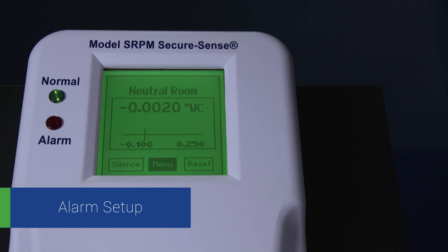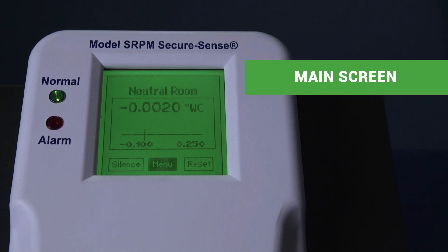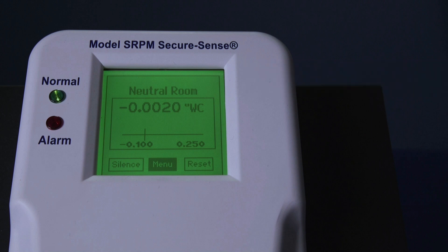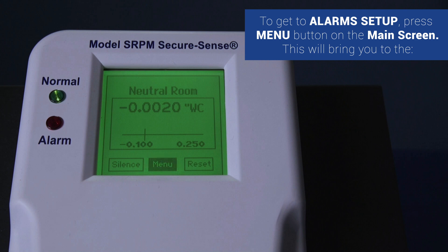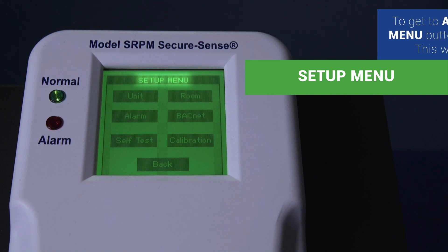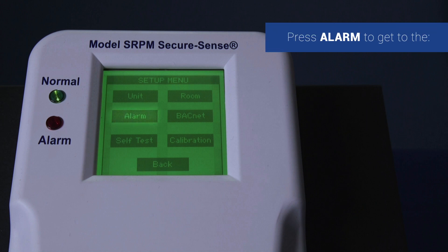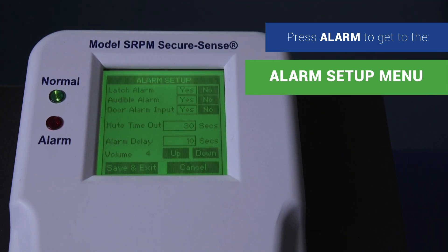Alarm set up. To get to the alarm set up, press the menu button on the main screen. This will bring you to the setup menu. Once at the setup menu, press alarm to get to the screen to set up alarm parameters.